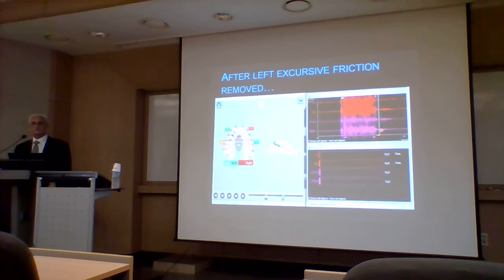And this phenomenon is what relieves the implants from shear stress and potential breakage.